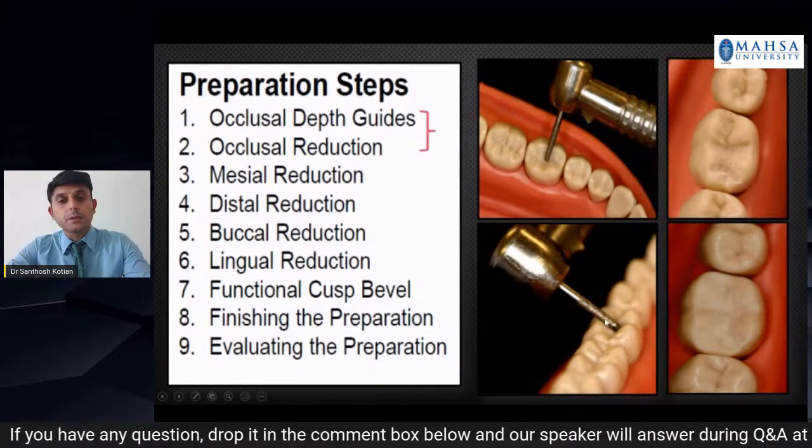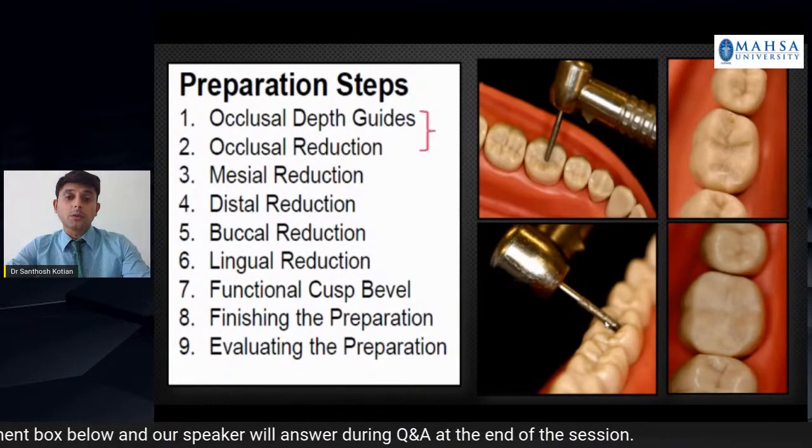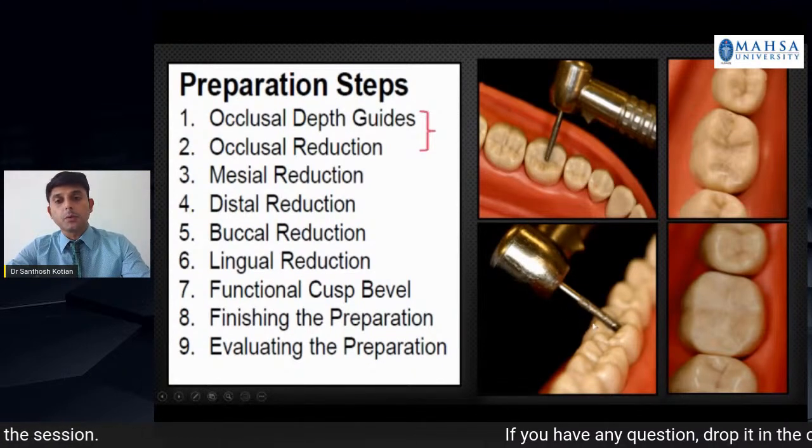And angulation of the burr, very important. Follow the angulation of the cusp. This is the basic rule. Okay, follow the angulation of the cusp. Do not change your burr angulation from that of the cusp. Okay, this is very important.